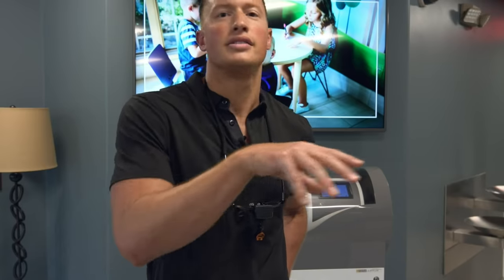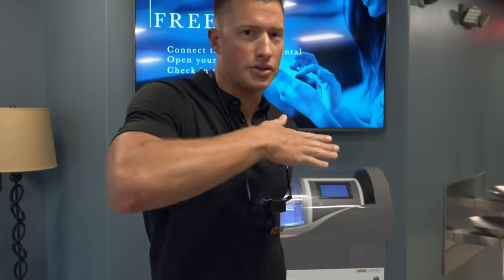Mini implants are great for a denture prosthetic, and that's what they're designed for. It takes 4 to 6 of those to give a proper amount of retention to hold a denture. So when you're talking about not a single tooth, we're obviously talking about dentures or maybe even a bridge. You can do 2 implants and then bridge that, and we've done that multiple times for people. You can also do multiple implants for a denture prosthetic, and that gets a little more complicated.